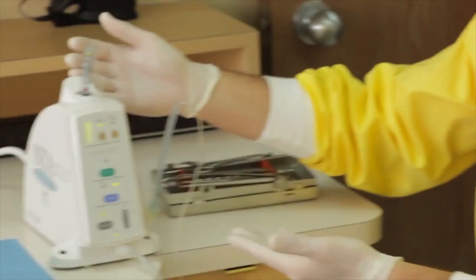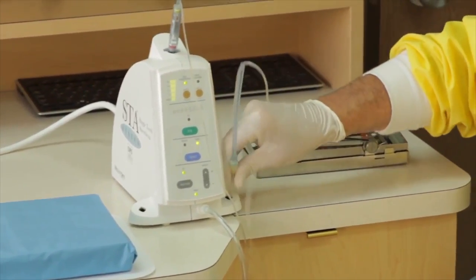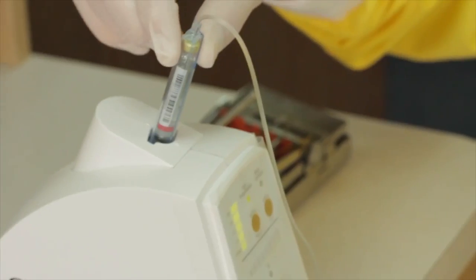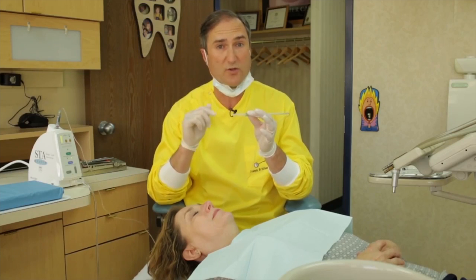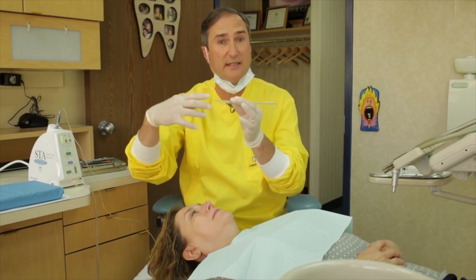I use the wand. The wand works by having a computer chip in this device, which senses the tissue in the mouth. It makes the anesthetic go through the cartridge of the anesthesia, all the way through this tubing into the needle tip and through the tip. Anesthetic goes out of the tip one drop at a time. Because it goes so slowly, it anesthetizes the tissue as the needle approaches.